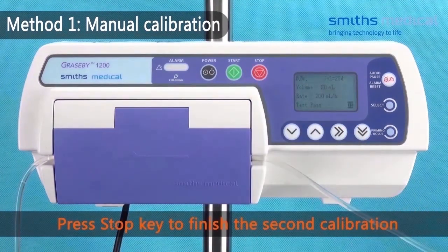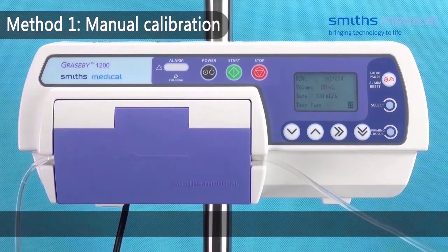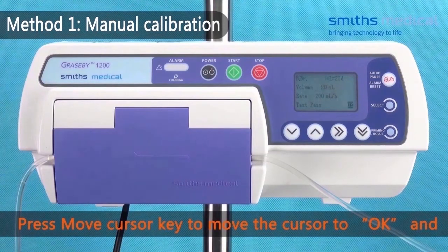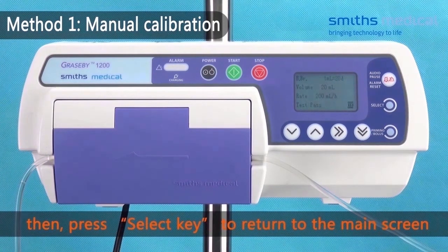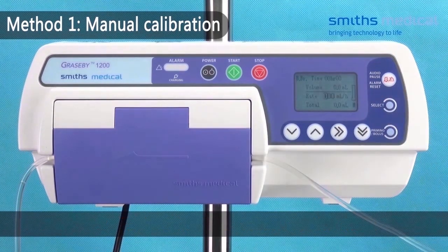Press the stop key to finish the second calibration. When the calibration is accepted, the screen displays OK. Press the move cursor key to move the cursor to OK, then press the select key to return to the main screen. Rate calibration is finished.